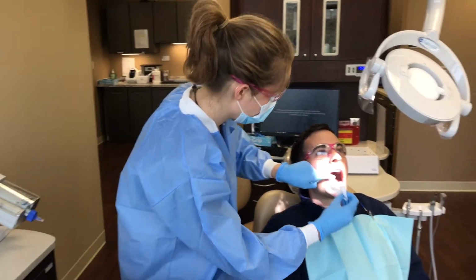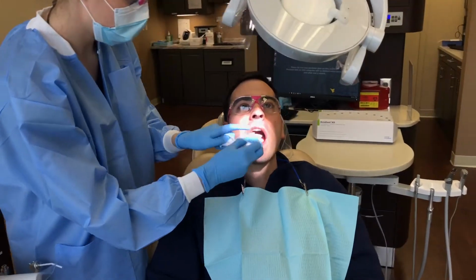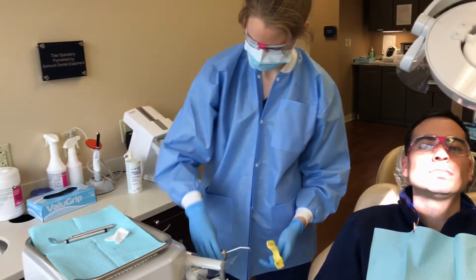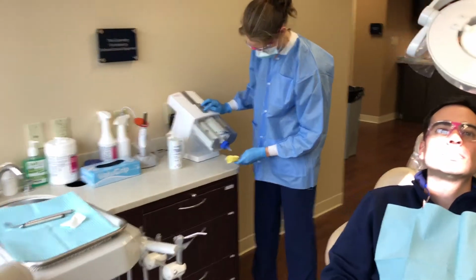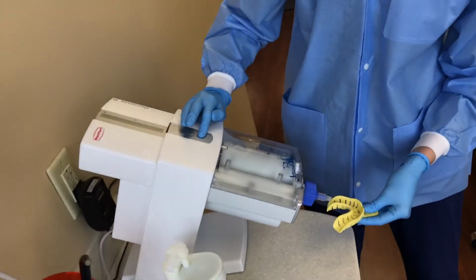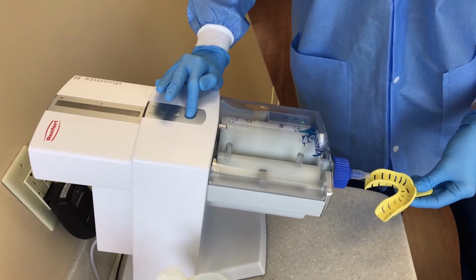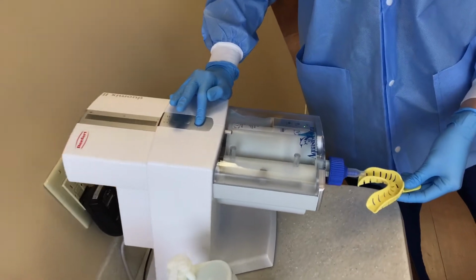Again, since this is a PVS material, we want to make sure the patient's mouth is very dry. So I'm going to have Pete bite down on some gauze while I am filling the tray. And since we had the reset button hit, it was all the way up to the top. Once it starts contacting the material, it'll start extruding from the machine.